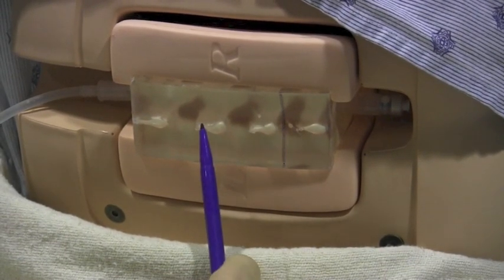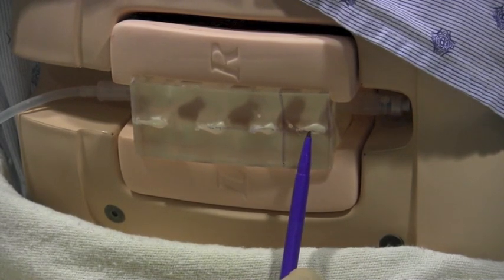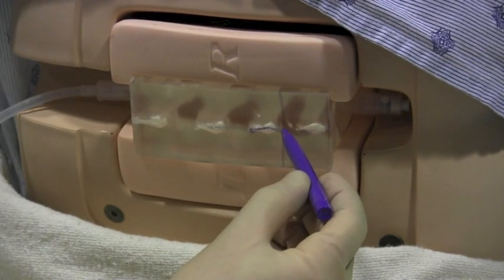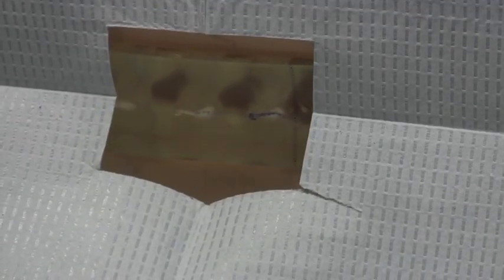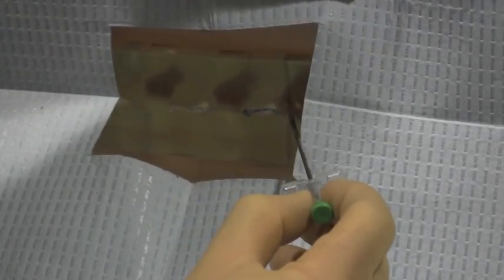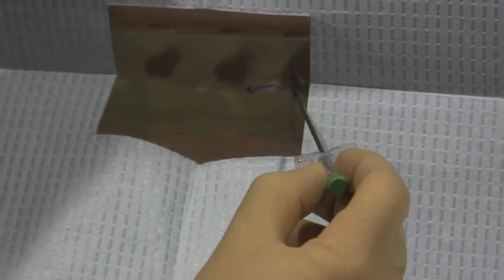Here, we've uncovered the spine to show the insertion site between the spinous processes in the midline. The pen is showing the angle of insertion. Once it is draped, the needle is placed at the crosshairs between the spinous processes and will be advanced.